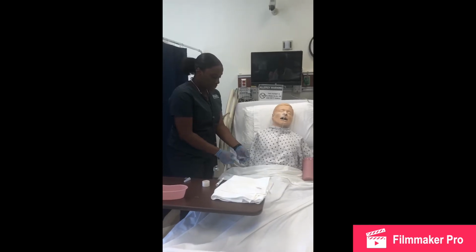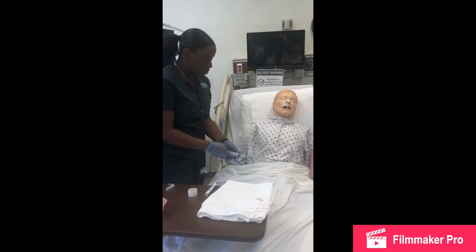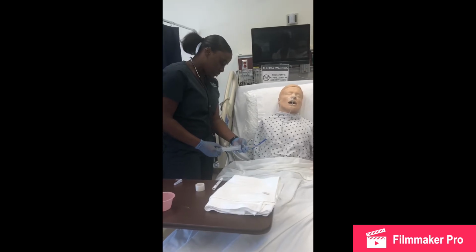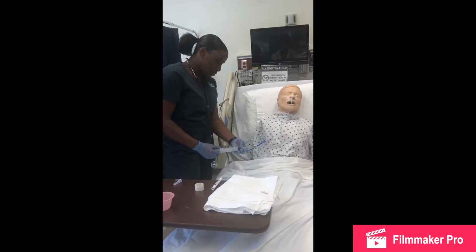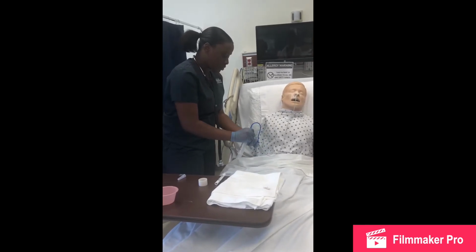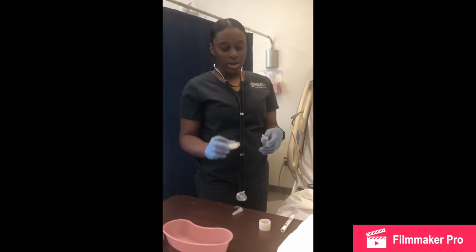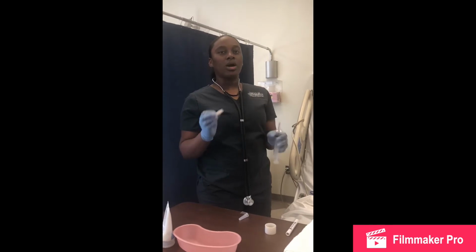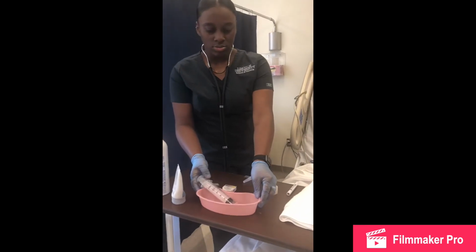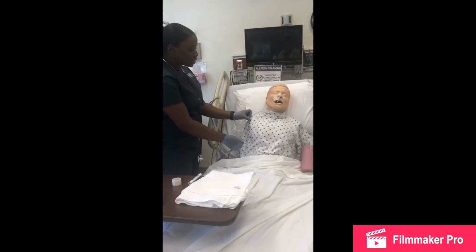Now I'm going to aspirate to test the pH of the secretions in my patient's GI system. I'm going to aspirate up until about 10 milliliters, 10 cc's. Carefully remove it, close it, and then I will test it with my pH strip right here to make sure that it is in the correct range. I will then put it in this vomiting basin, and then I would make sure I secure this on my patient's gown.